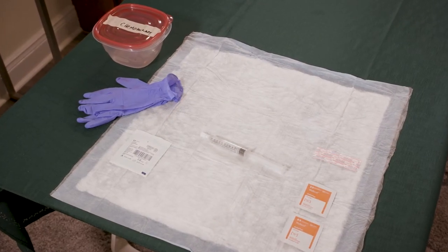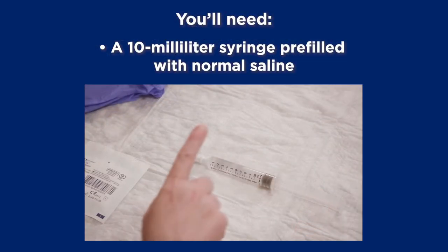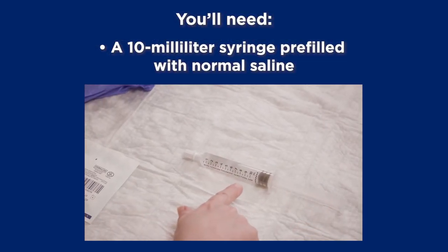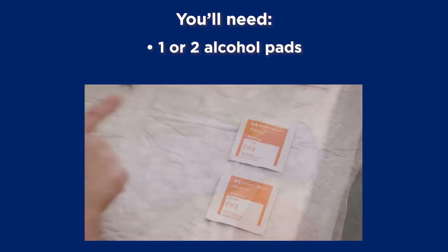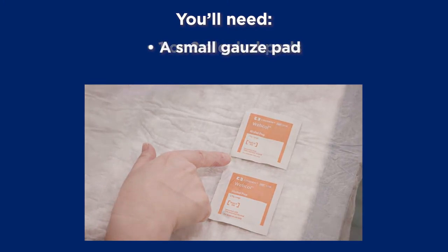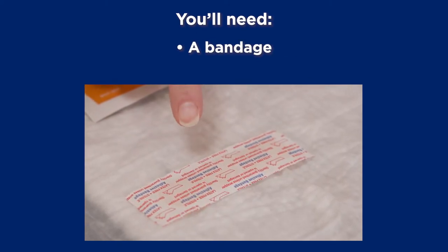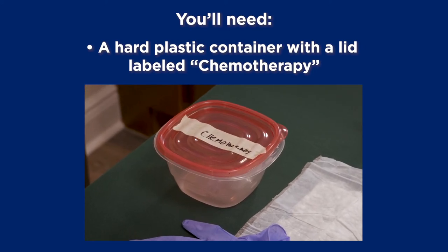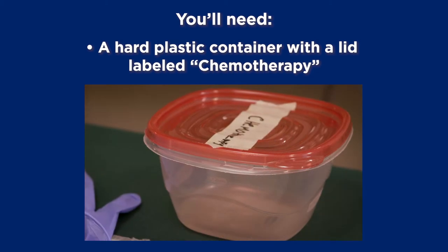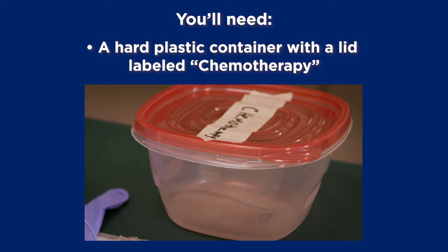Once your hands are clean, set up your supplies on a clean, flat surface — don't use your kitchen or bathroom counter. You'll need a 10 milliliter syringe pre-filled with normal saline, a pair of clean gloves, one or two alcohol pads, a small gauze pad, and a bandage such as a band-aid. You'll also need a hard plastic container with a lid labeled chemotherapy. Make sure it's strong enough that needles can't poke through the sides. Don't use a plastic or paper bag.